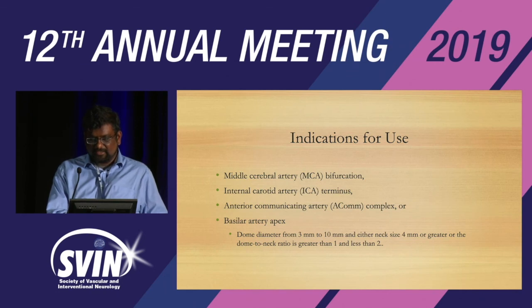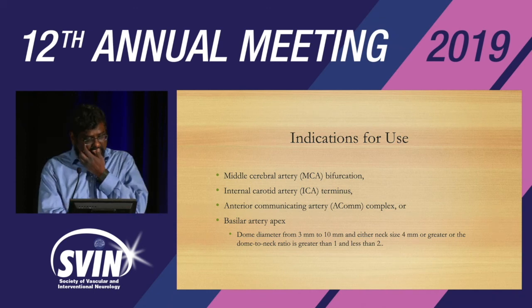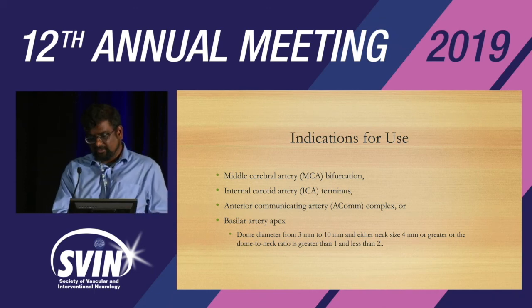Before anything else, these are the approved indications: MCA bifurcation, ICA terminus, ACOM, basilar apex. And obviously wide-neck aneurysms with dome-to-neck ratio more than 1 and less than 2.